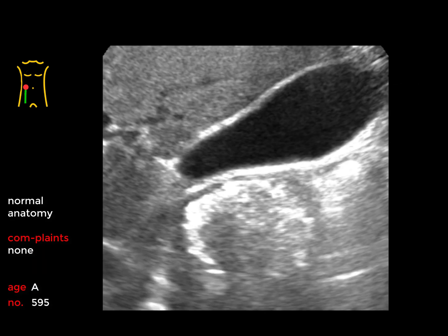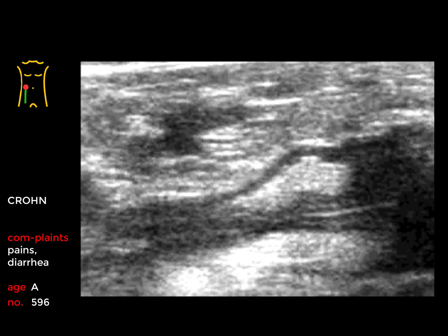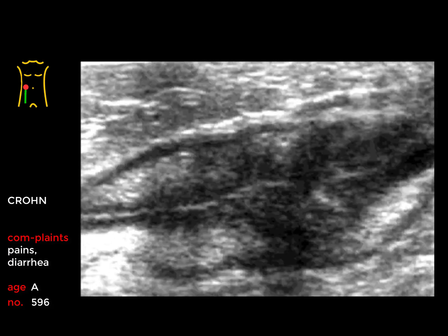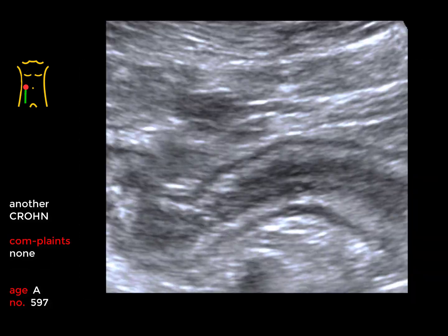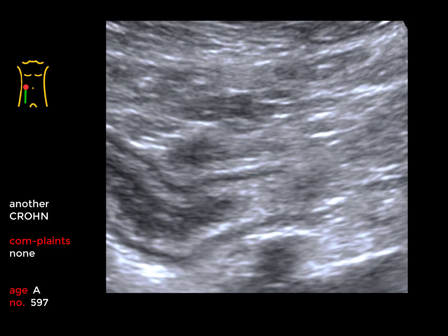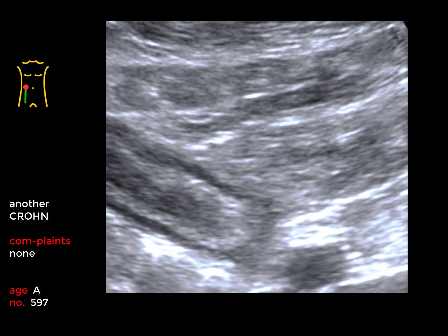In 595, again, the intimate neighborhood of duodenal bulb and gallbladder is pronounced once more, and again the clinically active Crohn is featured in case 596, loops being differently much affected. This is true again for case 597 with again thickening of the wall layers.